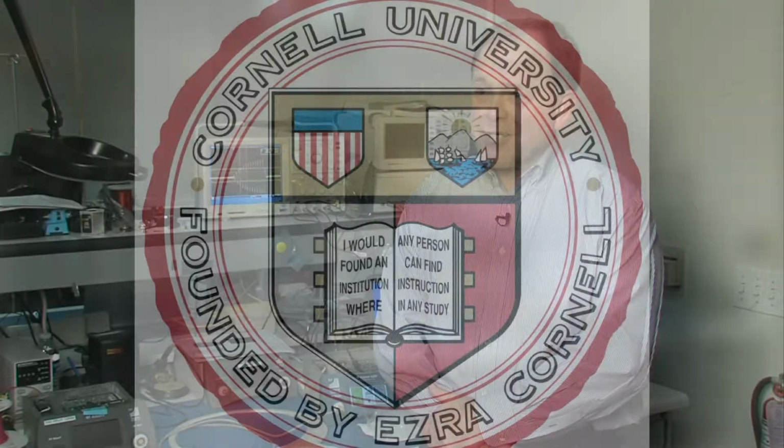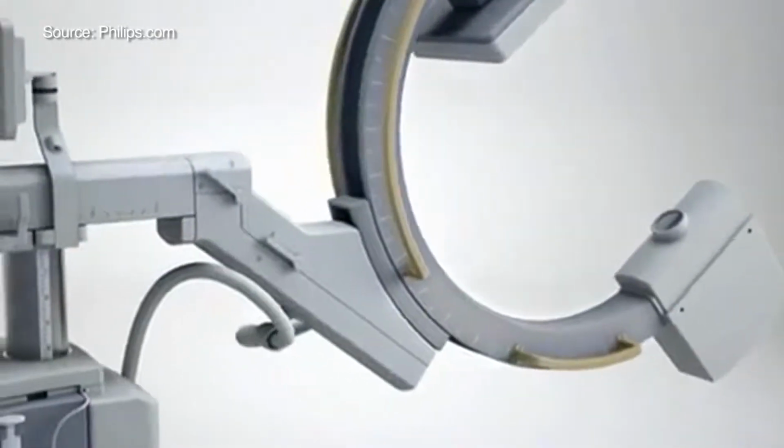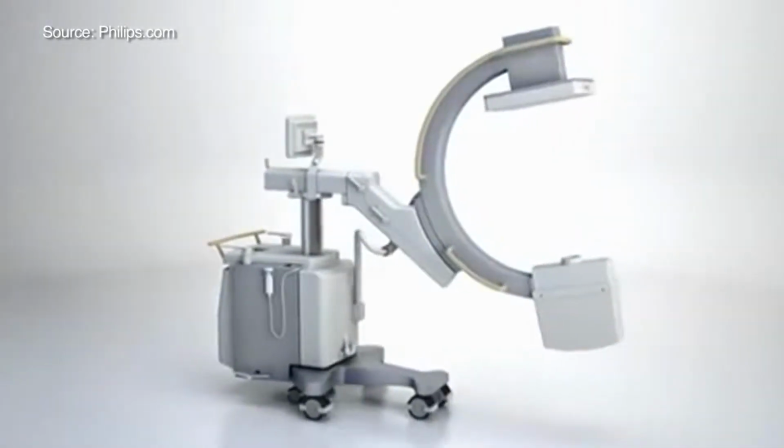He came up with the concept after a long, grueling surgery where, in essence, at the end, there was a miscount. They spent almost an hour trying to rectify the count through an anthill of bloody sponges and gauze. They counted them all. They had to bring in a portable C-arm, and he just thought there's got to be a better way. A C-arm is a portable X-ray machine. Patients are X-rayed if the sponge count is off.